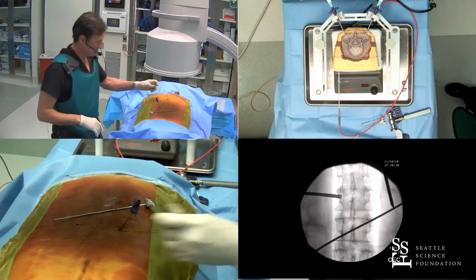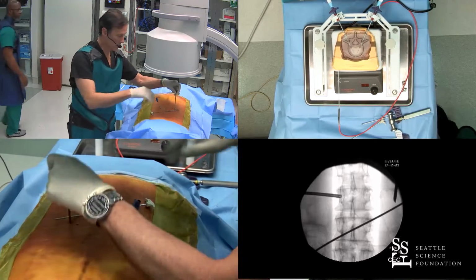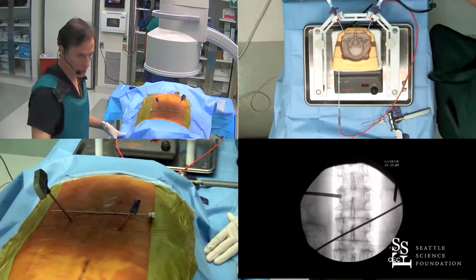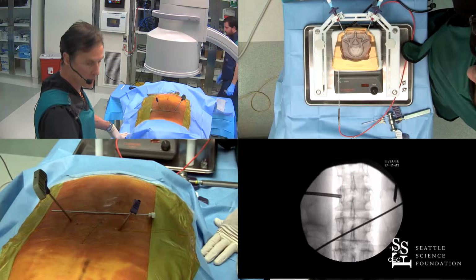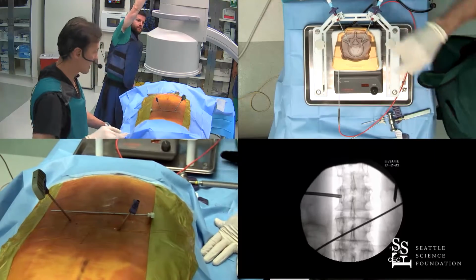So if we look, this is just slightly farther out than our transpedicular approach. So this is the same exact trajectory. So what this is, you'll note we were a centimeter up, 2 centimeters out for the transpedicular approach at the 2 o'clock position of this pedicle on the patient's right. And what this is along the same trajectory, just farther out.